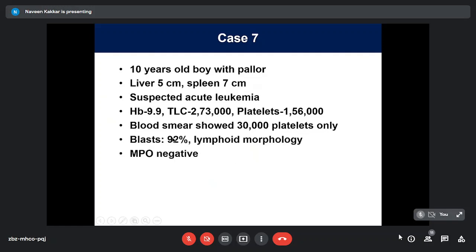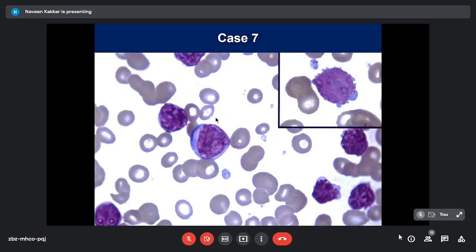The smear showed 92% blasts with a lymphoid morphology. Myeloperoxidase was negative. We advised the marrow, which was refused. Then we advised the flow cytometry. That time we did not have it in-house and he was referred elsewhere. That is what the smear showed. So these are the blasts, some nuclei there. These are 3 nuclei in a blast, and the blasts are shedding off budded cytoplasm here.